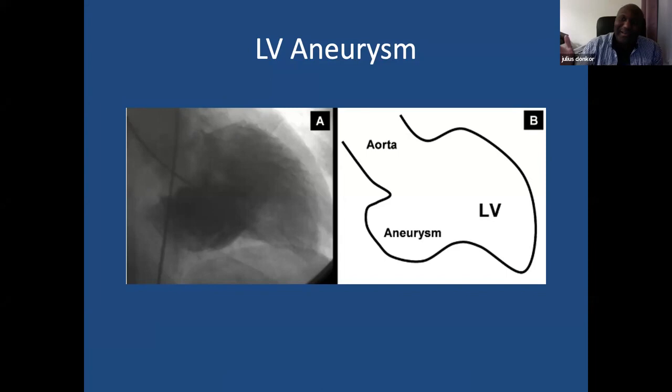Normal conduction is from endocardial to epicardial, transmural. Obviously, when you have an MI, the conduction is affected. For instance, why is the T wave upright? The normal QRS is upright and you've got an upright T wave, even though depolarization and repolarization are different. When you look at a QRS, it's positive and your T wave in most of the leads is positive as well. So it's depolarizing and then repolarizing. In normal conduction, the wavefront is from the endocardial to epicardial.